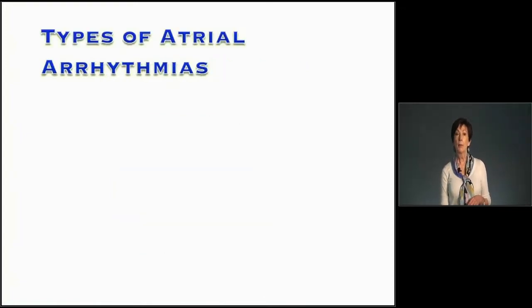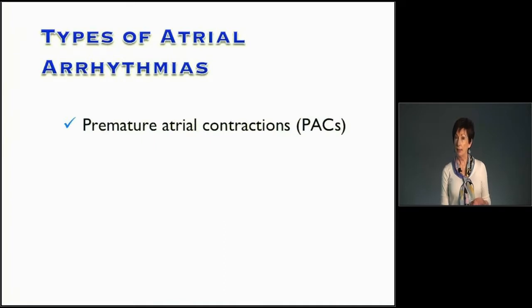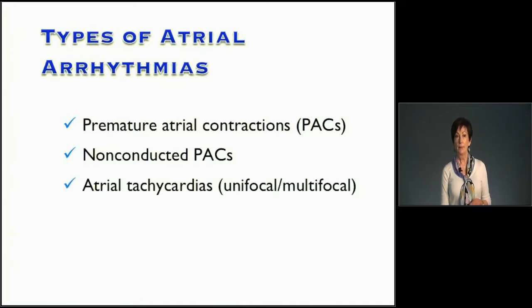So the types of arrhythmias that we'll be discussing are PACs, premature atrial contractions, non-conducted PACs, atrial tachycardias, and then we'll break that down into unifocal atrial tachycardias and multifocal atrial tachycardias. We'll also talk about atrial flutter and then wind up with atrial fibrillation.